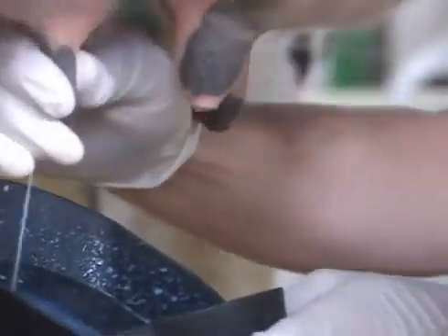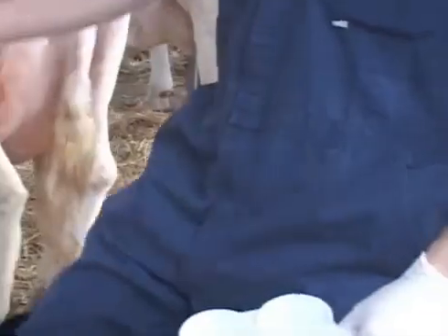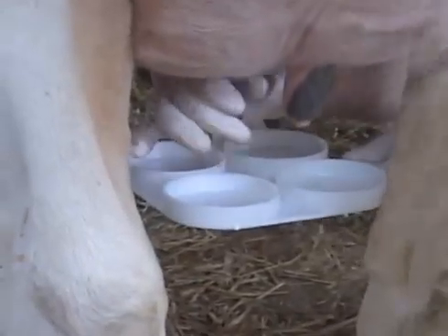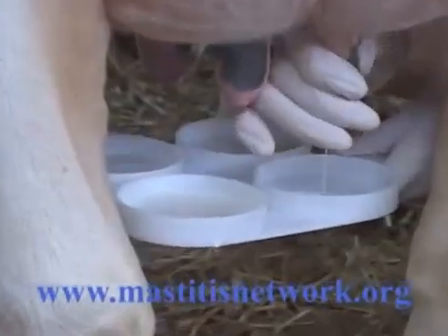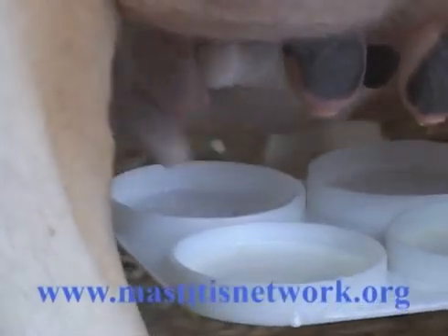The first step is to make sure the teats are clean and free from dirt. Then, forestrip in a strip cup and check for abnormal milk. In step 2, always use the same paddle position from cow to cow, always on the same side of the animal, right or left. This will make it much easier to keep track of quarters when interpreting results.